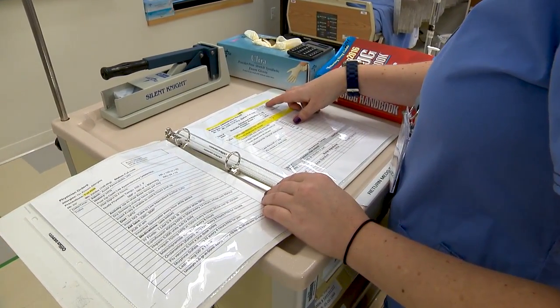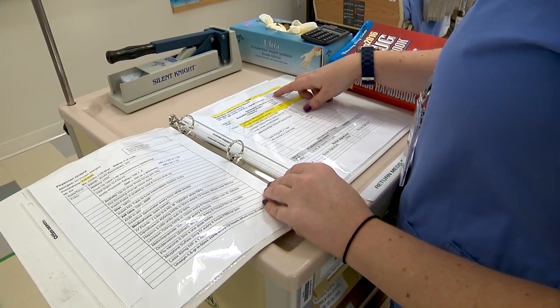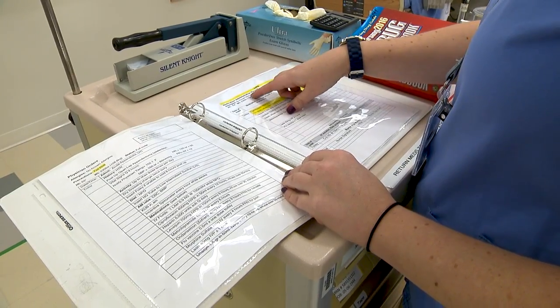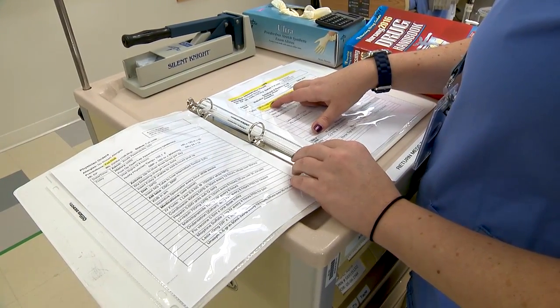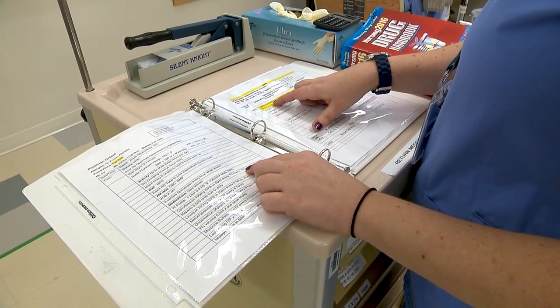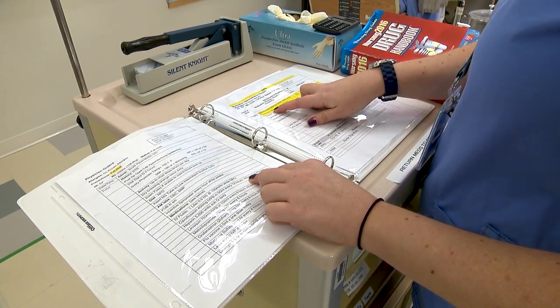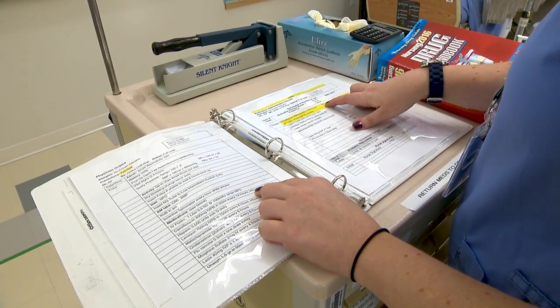Again, I have Morgan Brown, date of birth 8/4/70, MR number 589-135-1325. He has no known allergies, and I see here he has an order for ciprofloxacin 400 milligrams in 50 mLs IV piggyback every 12 hours to infuse over 60 minutes. It's ordered today at 9 a.m.